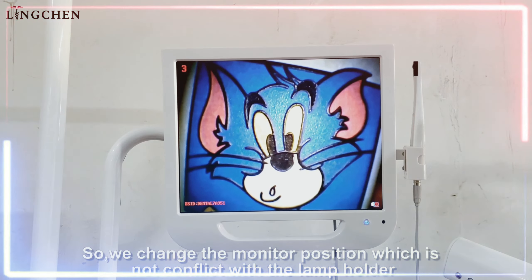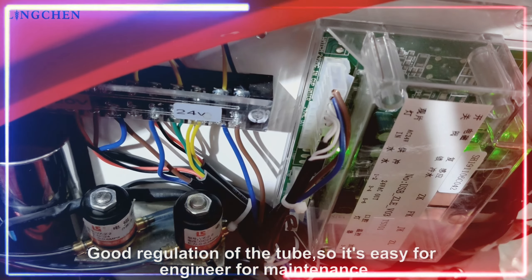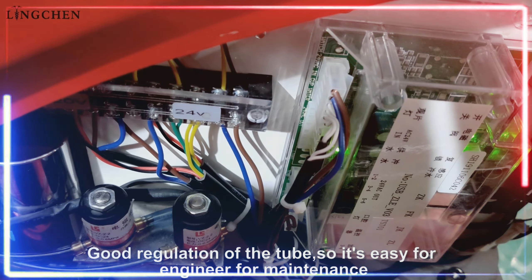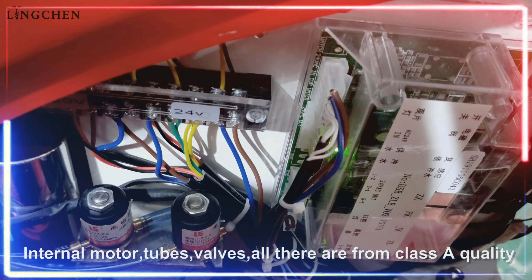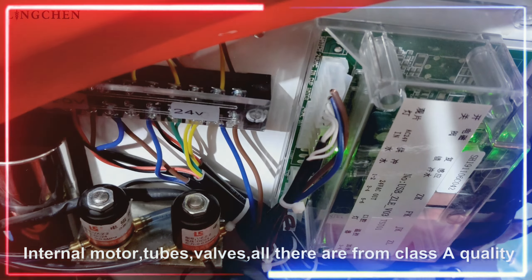Bigger and wider unibox. Good regulation of the tubes, so easy for the engineer for maintenance. The internal motors, tubes, and valves — all are Class A quality.